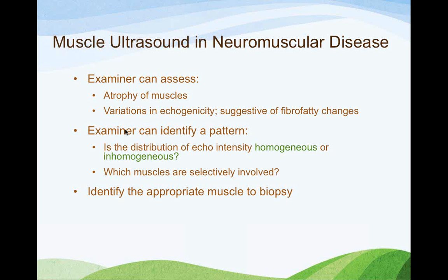This is something that is also typically done with EMG. The downside to doing this with an EMG needle to pick up on myopathic changes in an electrophysiological way is that you actually damage the tissue when you're doing the EMG, and it leads to inflammatory changes within the muscle. So typically when you do the EMG, you can't biopsy that particular muscle. You have to do the same muscle on the other side. And there are many times where people make mistakes with regard to that.